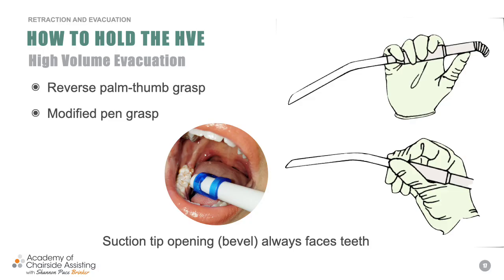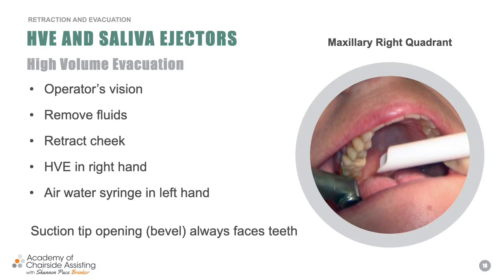Keep the HVE tip far enough away from any mucosa or tissue to prevent it from being sucked into the tip, okay? And when it does, it's going to make a loud noise. And sometimes the doctor can jump, the patient can jump, and guess who else is going to jump? You, okay? So looking at the palm thumb grasp, pen grasp, all right? We've got to practice here.